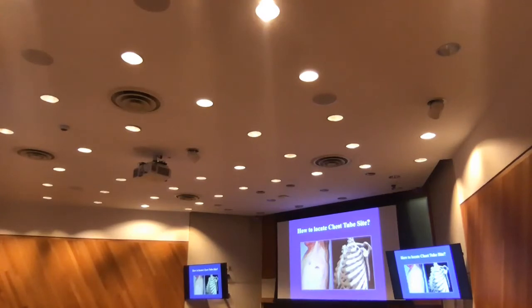So here we are. You are going with the protuberance, the second rib. By the way, whatever rib you feel in front first, some say that's the first rib, but I don't agree, because you will not be able to palpate the first rib. Why? It's hidden underneath the collarbone. You're going to palpate the second rib, but this is a more sure and certain way: I go from the angle, second and third, and then keep going to the fourth rib until I reach the sixth rib.